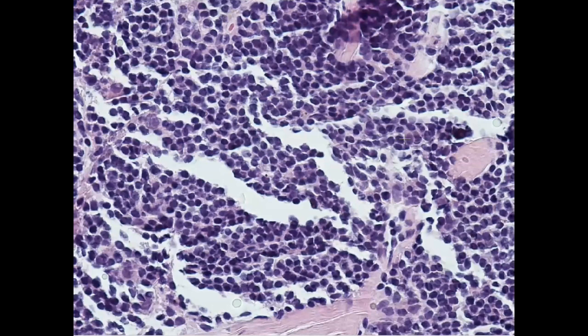For this, our differential diagnosis may be marginal zone lymphoma or lymphoplasmacytic lymphoma, though LPL is rare to happen in the lymph node. With some stains, we will be able to differentiate the indolent lymphomas, whether it's CLL, SLL, mantle cell lymphoma, marginal zone, follicular, or lymphoplasmacytic lymphoma. So we will need to go through several stains to differentiate.